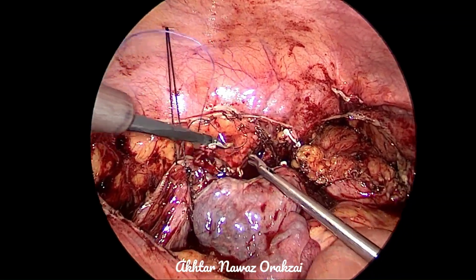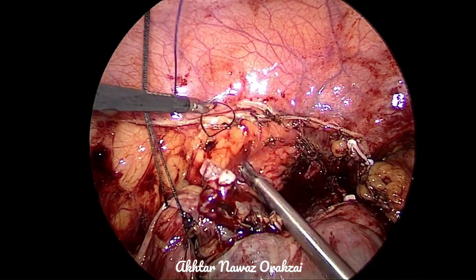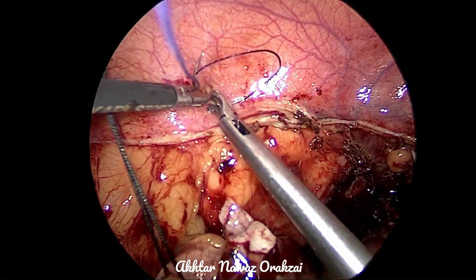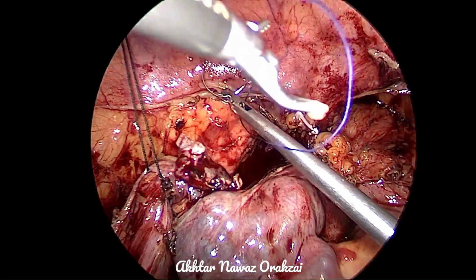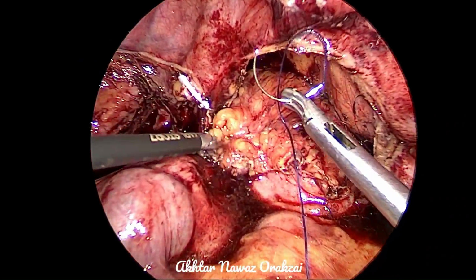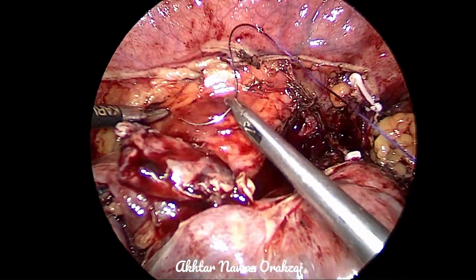Now, a Vicryl 2-0 suture is taken, and this suture will fix the extravesical tissue with the psoas muscle, the fascia of the psoas muscle. Care must be taken not to take the bladder itself.